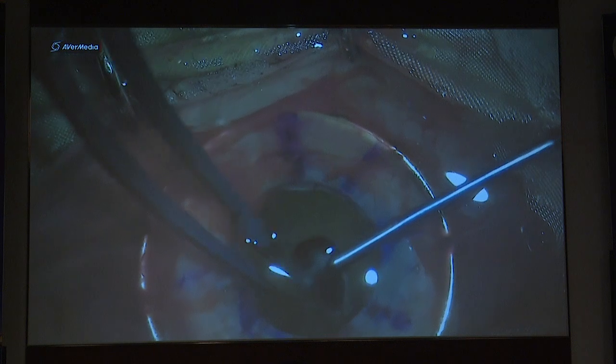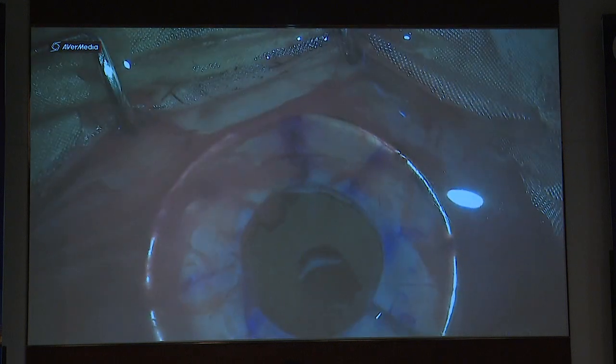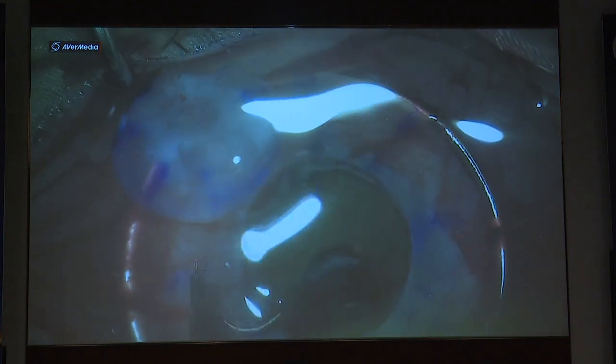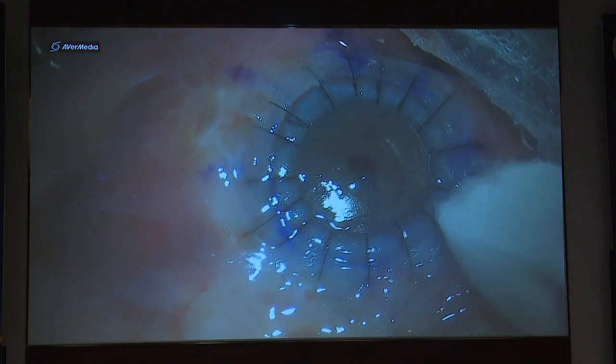On cutting the host, to my surprise, there was no IOL. There was a fibrotic posterior capsule with a pre-existing rent adhering to the iris. So I did a gentle synechiolysis. Retina surgeon not available, IOP too low, no way to make scleral flaps now. So thought of doing a pinhole pupilloplasty for this patient to achieve maximum visual outcomes. Did the anterior vitrectomy and removed all the fibrotic capsule in the optical axis. And then did the suturing.